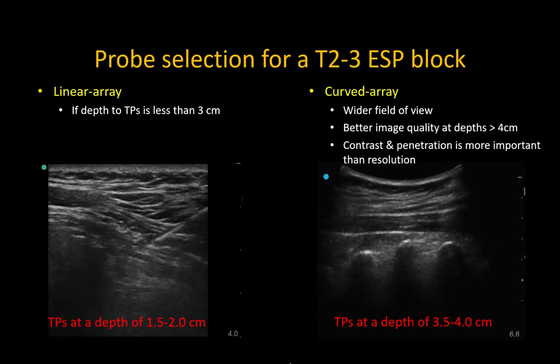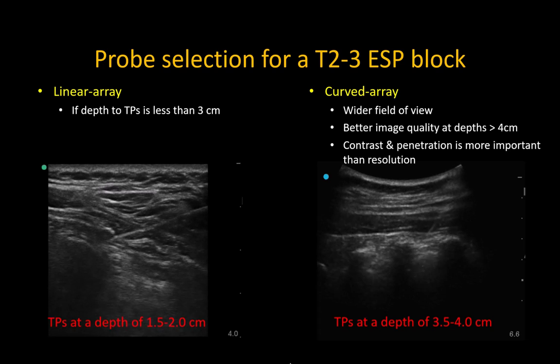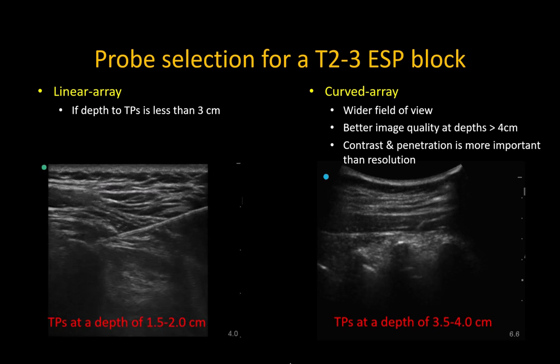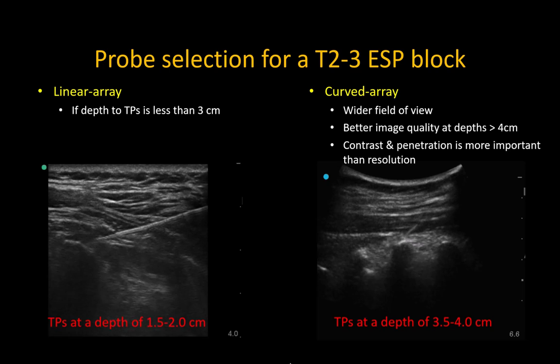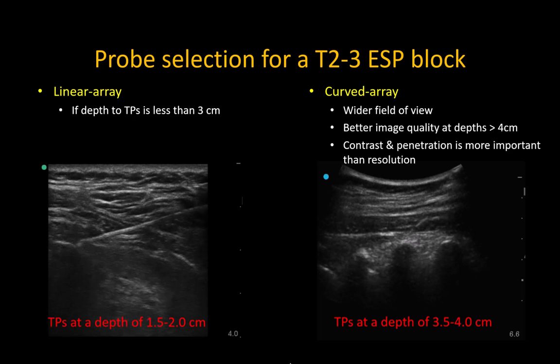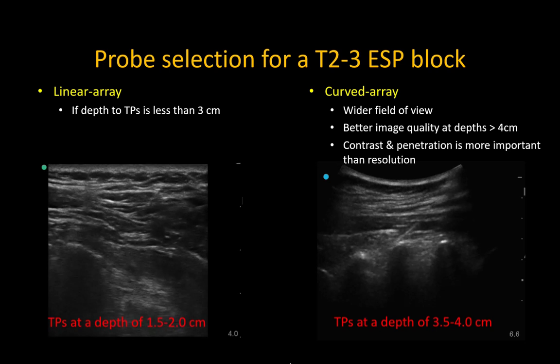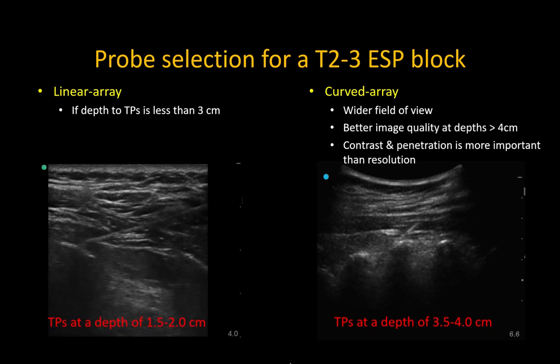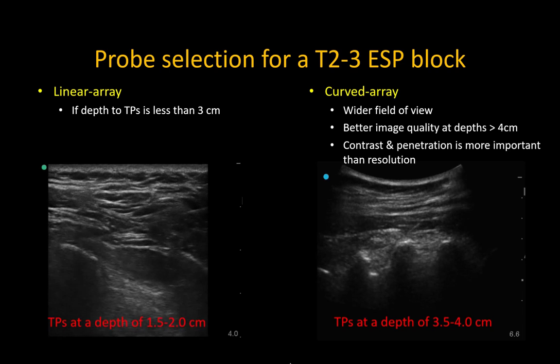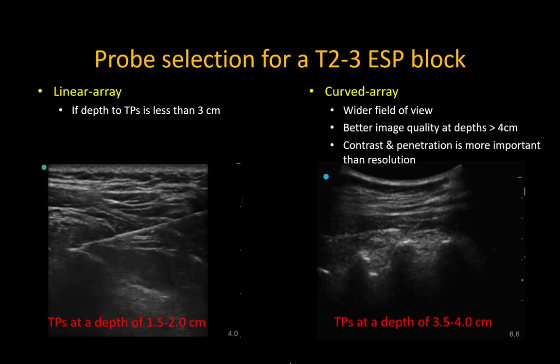Depending on the body habitus of the patient, use either a linear or curvilinear probe. The linear probe is suitable if the overlying tissue depth is less than 3 cm, but anything more than that, the image becomes muddy and it's hard to clearly visualize fascial layers and the spread beneath them. Adjusting the probe setting to the lower end of the frequency range can improve image quality. In larger patients with deeper structures, I recommend the curvilinear probe as it provides a crisper, clearer view of the muscles, fascia, bony structures, and fluid spread between them.